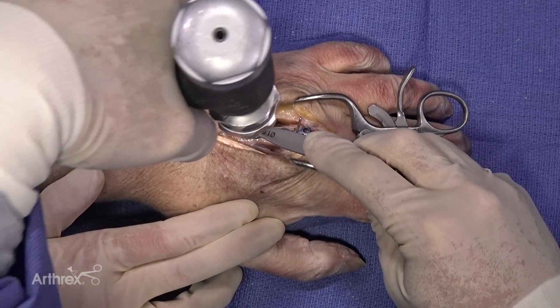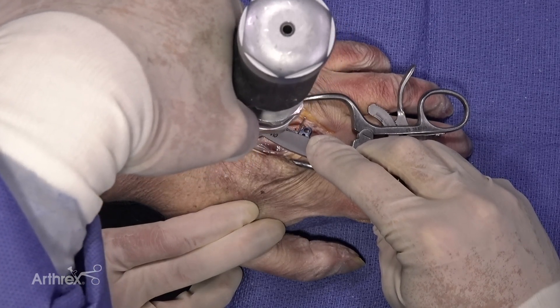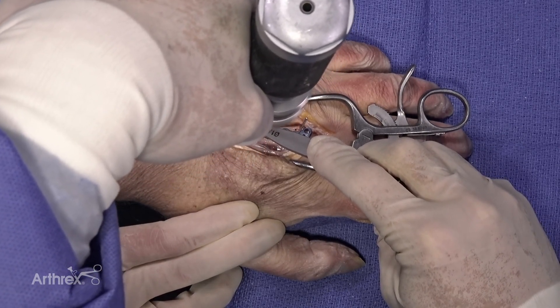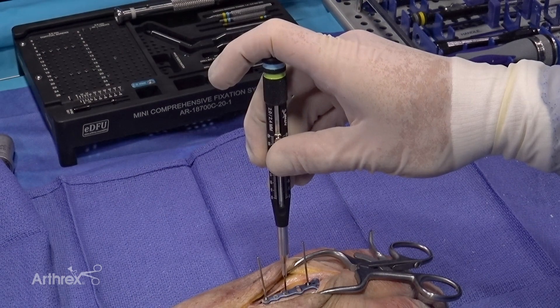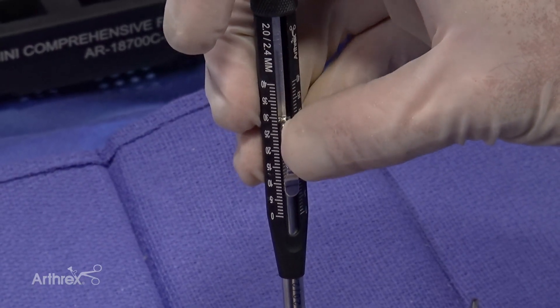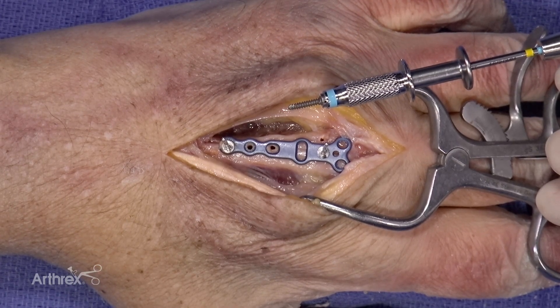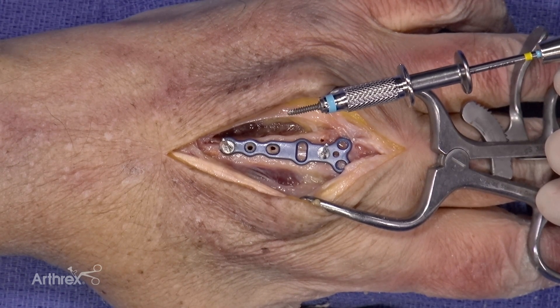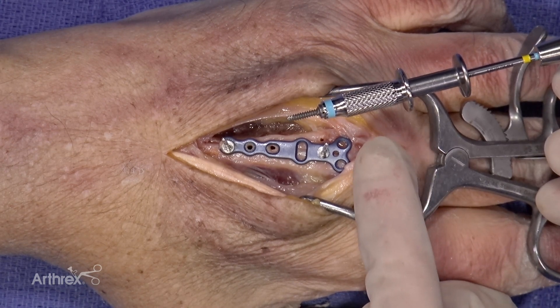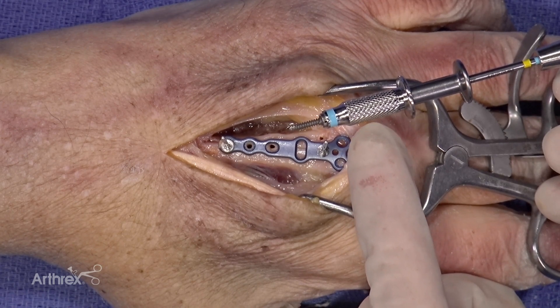Next, I will drill the three holes proximal to the oblong hole. Once the holes are drilled, the size-specific depth gauge is then used to measure the length of the screws. Once the appropriate length screw is measured, it is placed under the screwdriver. It is held securely to the screwdriver by this screw holding sleeve, which is one of the defining features of the set.